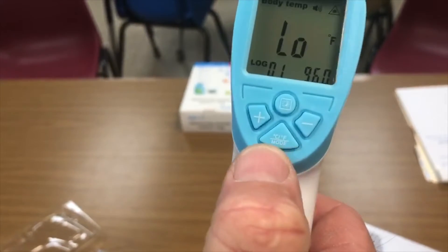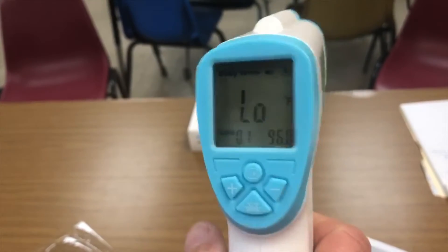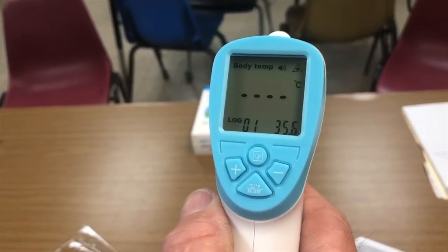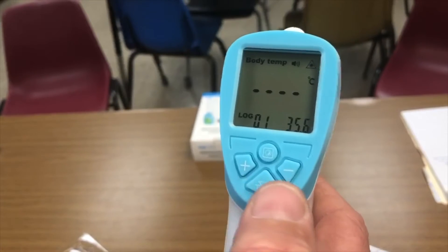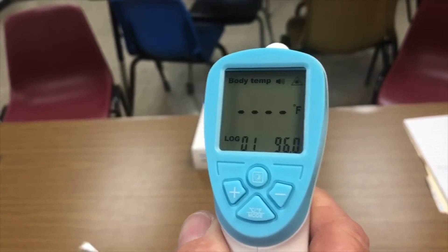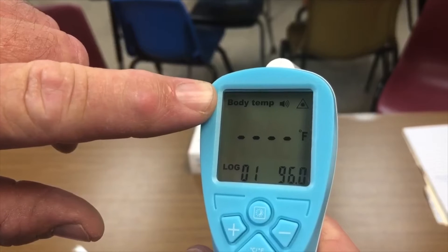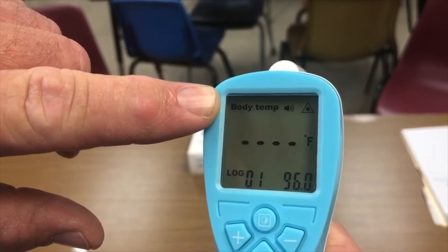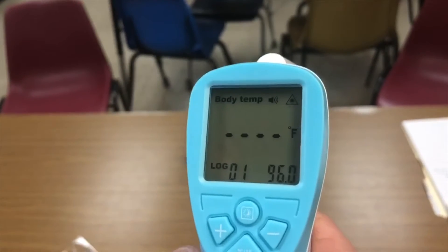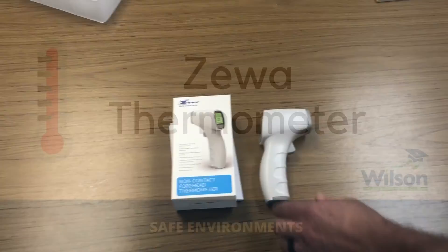If somebody hits one of the Celsius or Fahrenheit mode buttons on the back, it will change from Fahrenheit to Celsius. To change it back, press the mode button, squeeze the trigger one time, and it goes back to Fahrenheit. Make sure it's set to body temp — body temperature is what we're trying to measure, not surface.